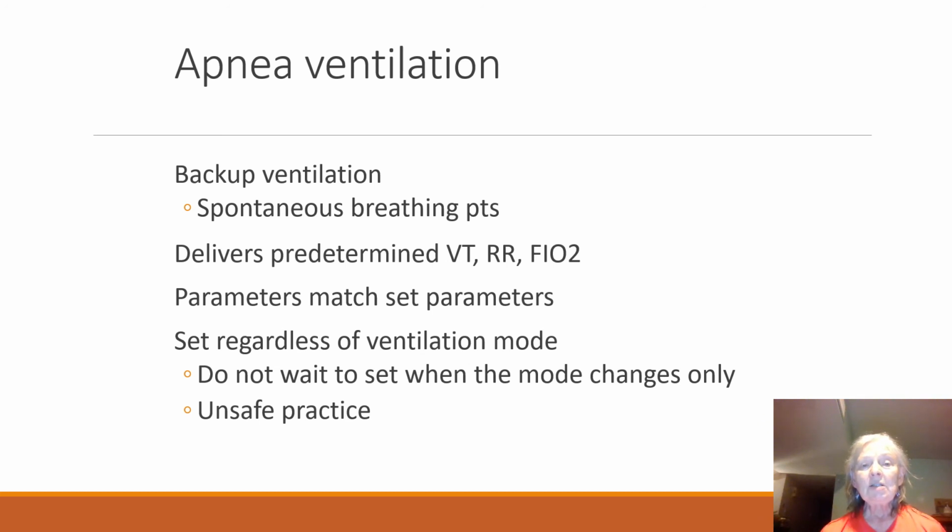Apnea ventilation, some people will call them the apnea alarms, doesn't really matter. Apnea is backup ventilation. That's backup ventilation to the spontaneously breathing patient. And the question comes in and says basically, well, why would you have a spontaneously breathing patient who stops breathing? Well, let's say something happens. Let's say that they perhaps had a stroke or something else that happened to them and they're now not breathing anymore. Let's say that they had a procedure done and they gave them some sedation, a little bit too much or for some reason, and so the patient's not breathing anymore.